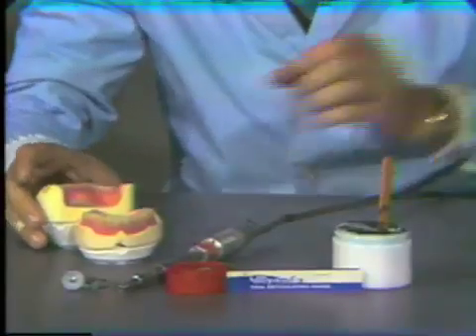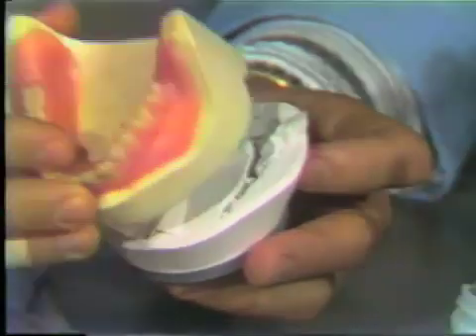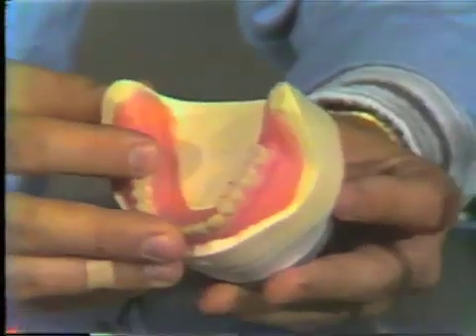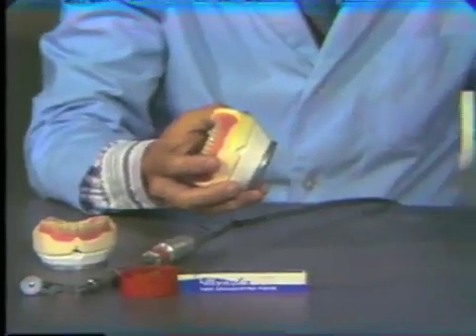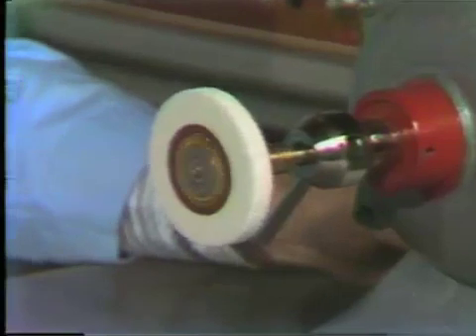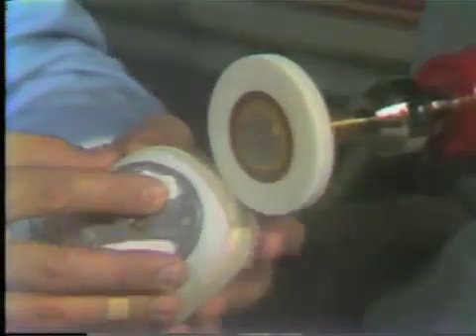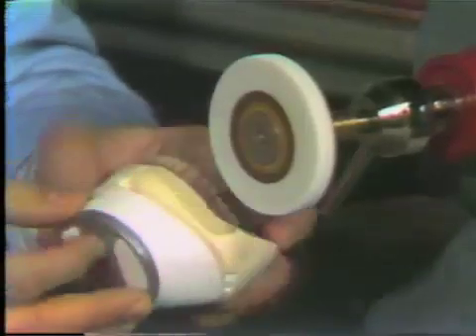For this exercise, these dentures have been processed via the split cast technique. The processed dentures are allowed to remain on the stone model, and they are now returned to the mounting with these keys so that this post-processing bite correction can be done. The procedure to place the mounting and the master cast back together utilizes a fast-cut wheel in the dental lathe, and small grooves are placed in the master cast and in the mounting. This is done on each side.